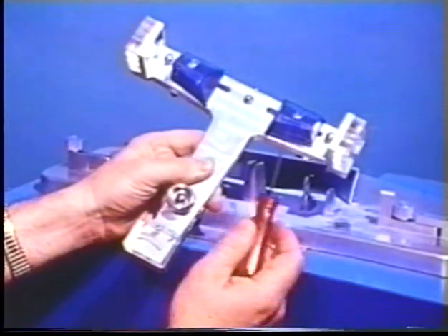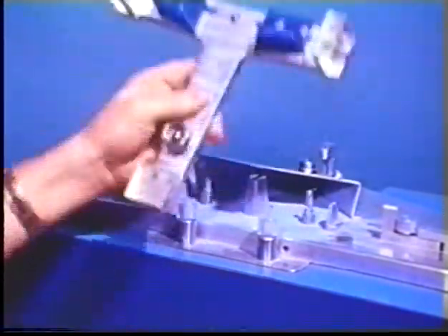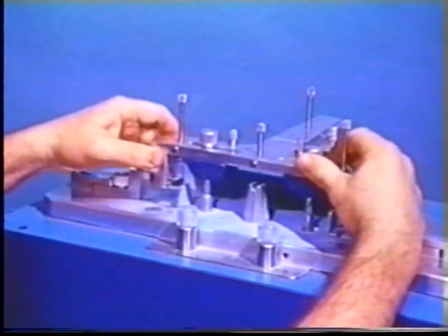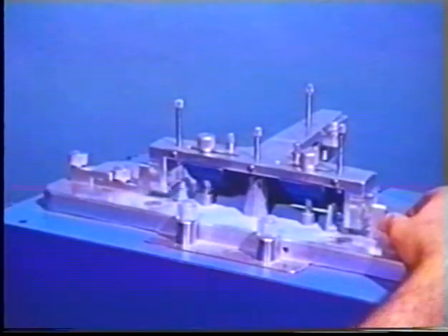The pointer is indicating that the patient's recording blocks have now been reversed to expose the lateral border recordings to the guide pins. The analogs are repositioned over the vertical mills in centric relation, and the guide pins are inserted into the lateral border recordings.